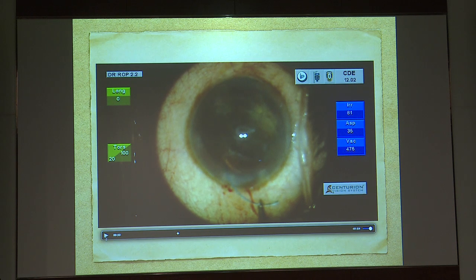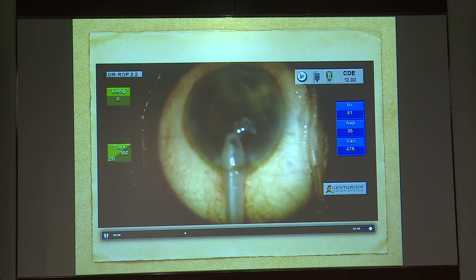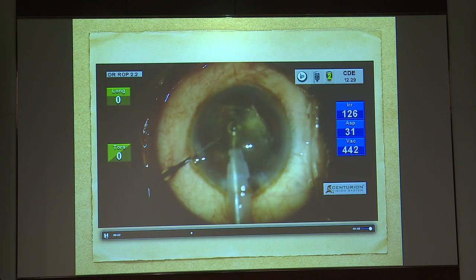Many times as a surgeon, we feel that there should be something from inside which doesn't allow the nucleus to fall down. So what can come to the help? IOL scaffold is a very good technique for it. What is done here is that a 3-piece lens is implanted into the eye. The haptic of the 3-piece lens is placed over the iris.